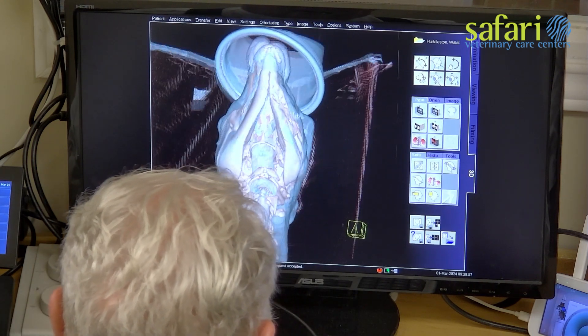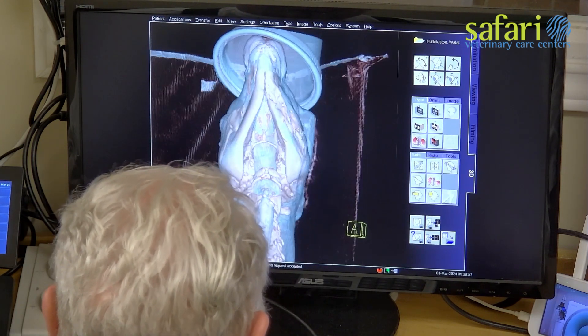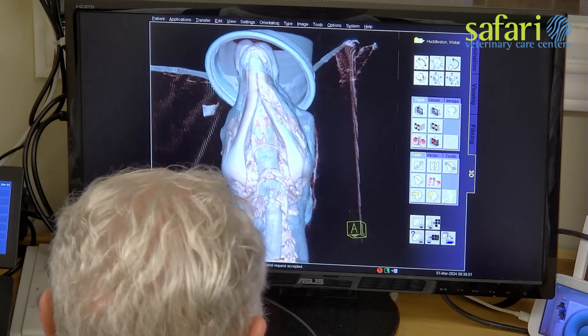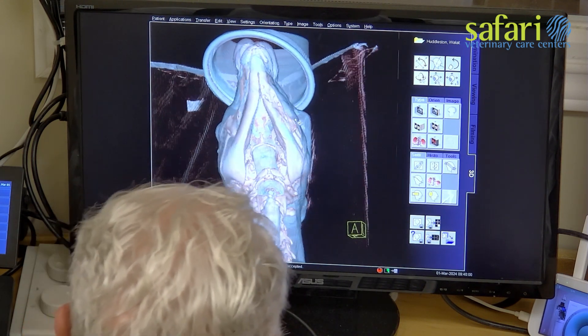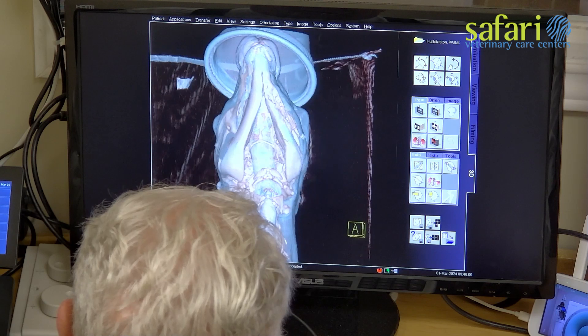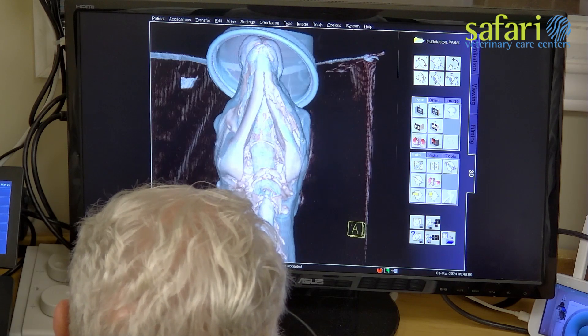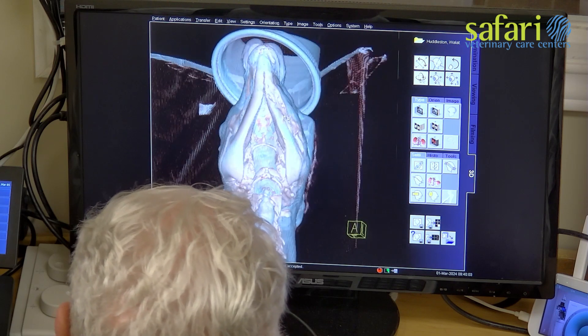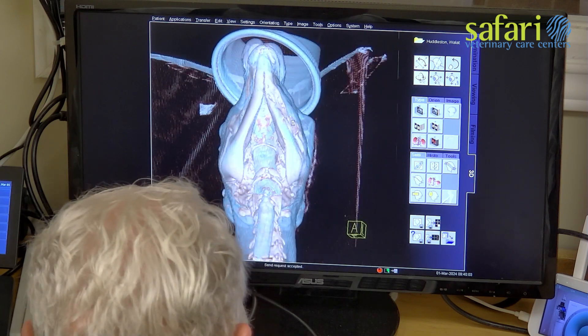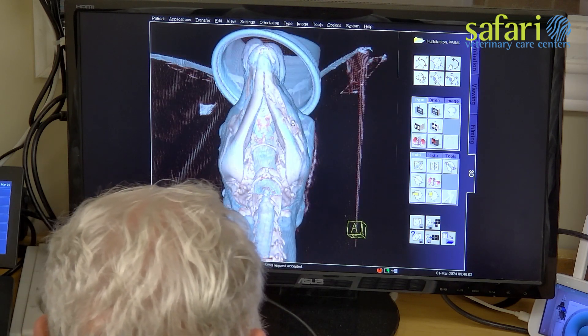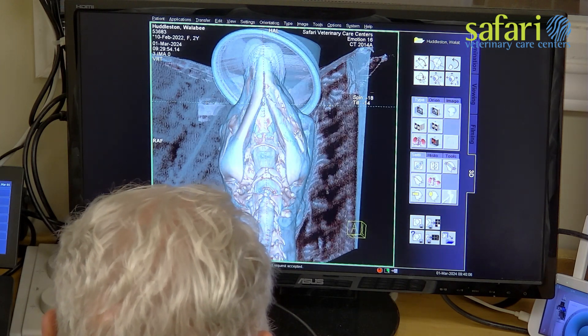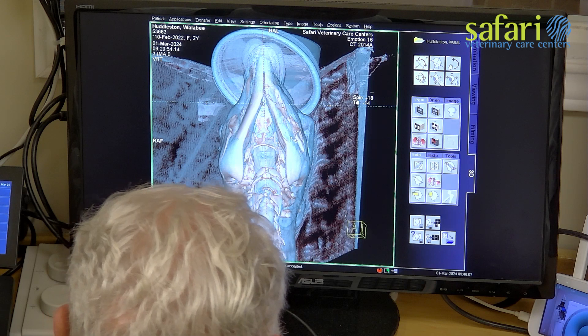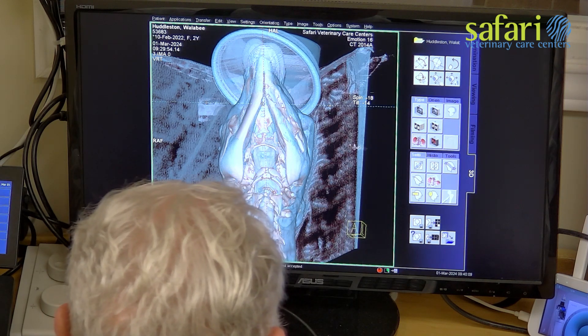The image can now be rendered in three dimensions, allowing us to rotate and examine not only the damaged bone but also other structures such as the skull, trachea, larynx, and vertebral bodies, aiding in our surgical planning.